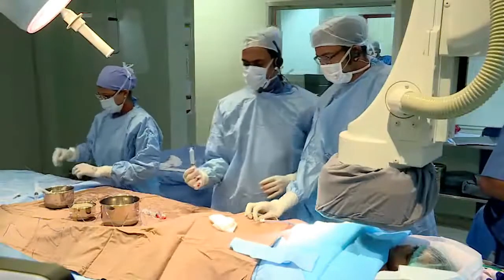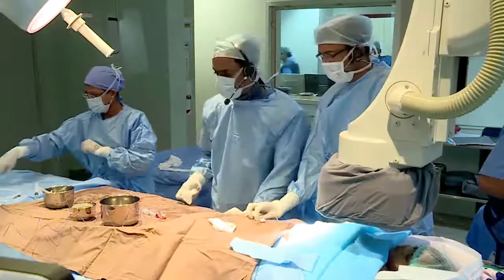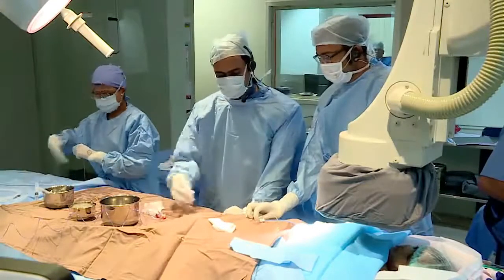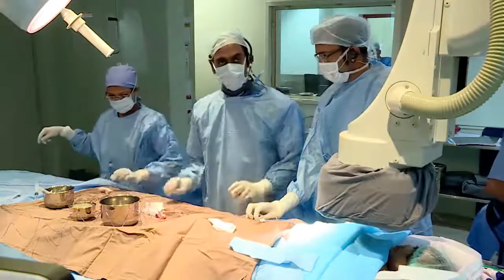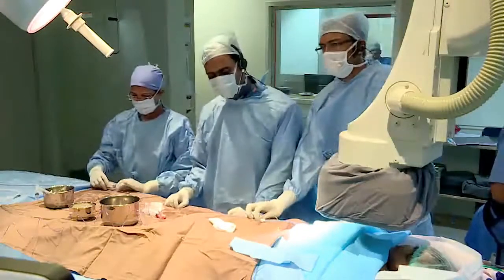So after the interesting morning and afternoon session, now we have a PDA. We want to show a child with a PDA. Ravindra, can you give the patient details?